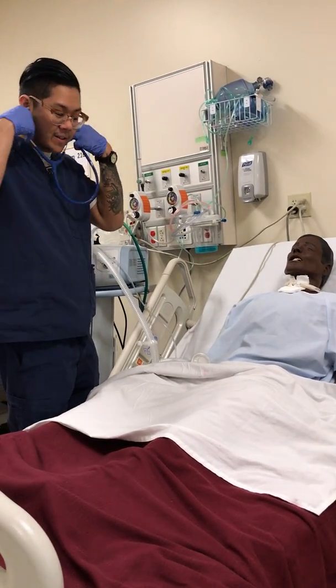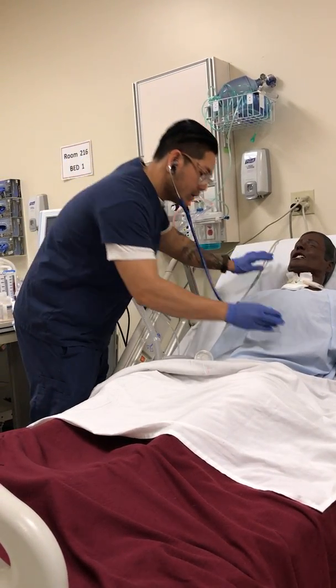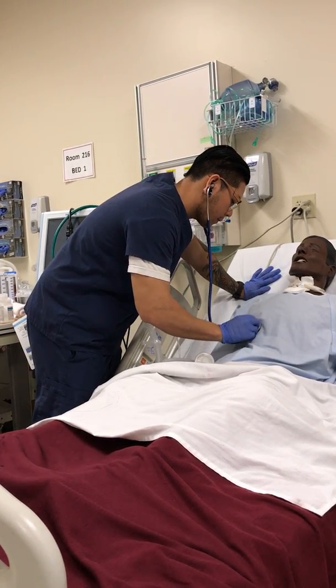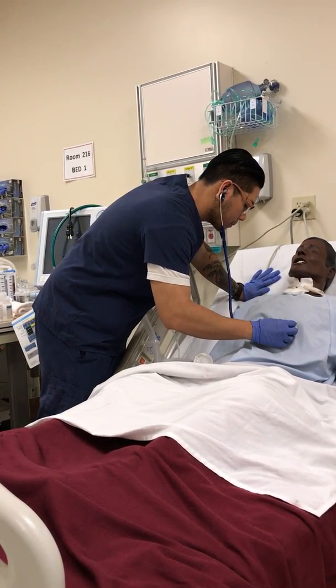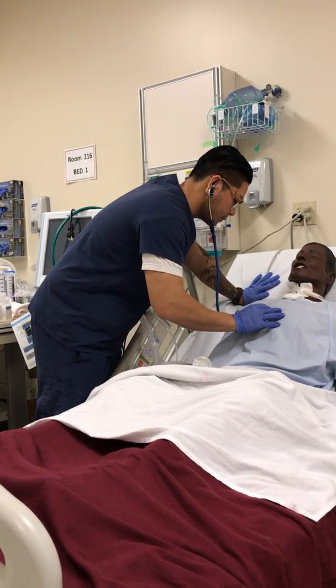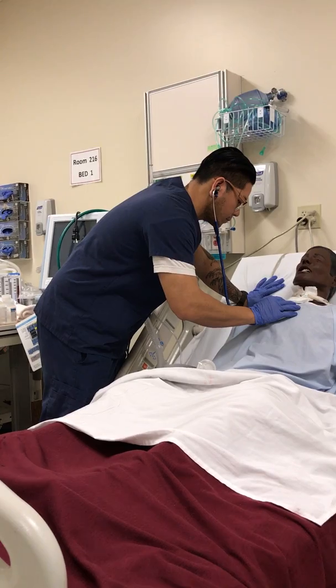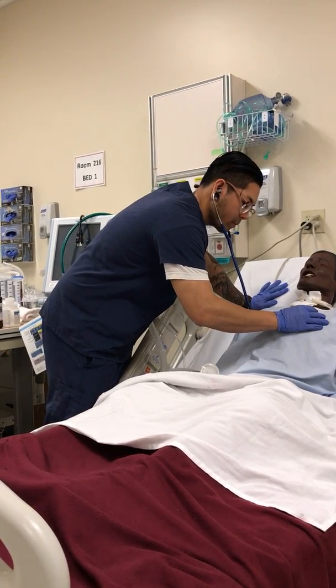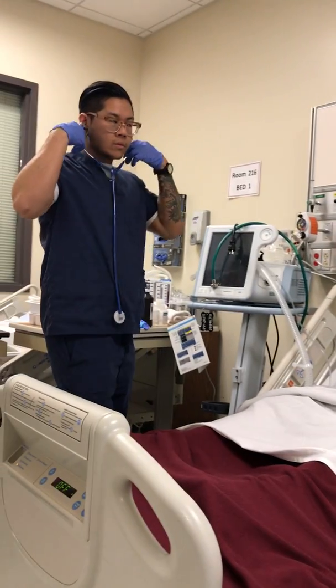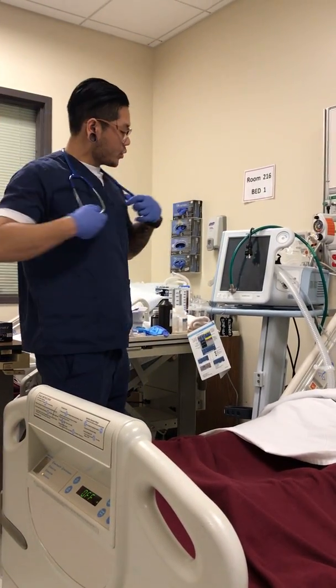Okay. All right. Take a deep breath in. So assess the patient. He knows what you're going to do.